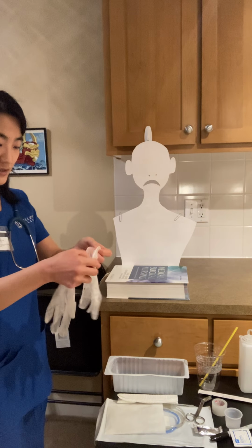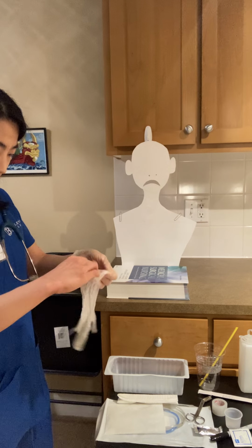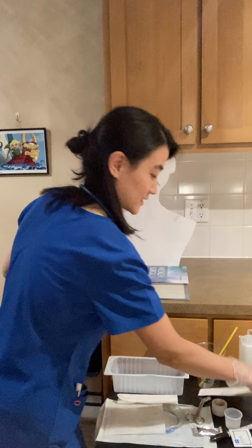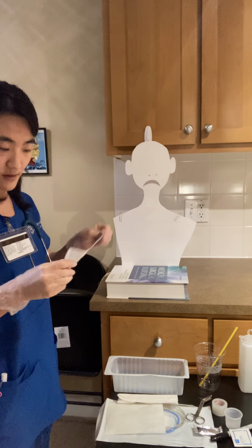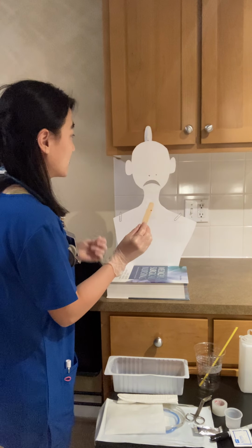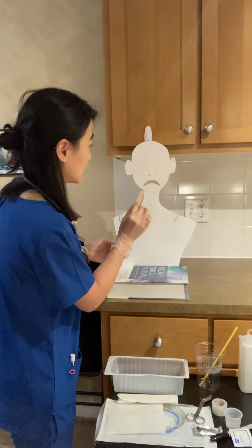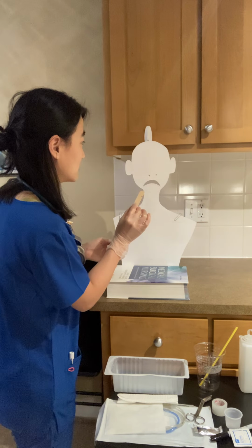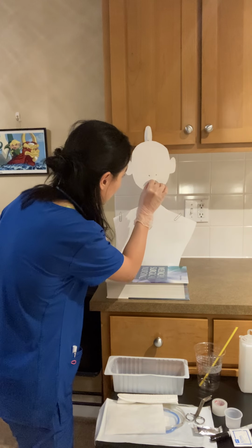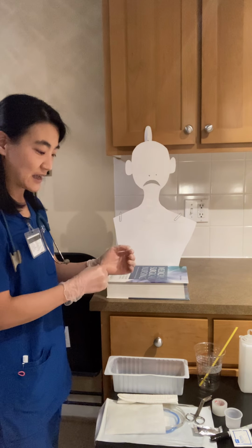I'm going to put on some gloves. And I'm going to assess for his gag reflex using this tongue blade. Alright, Mr. Nguyen, can you open your mouth and stick out your tongue? I'm going to use this tongue blade to gently touch your uvula at the back of your mouth, and that is to just test your gag reflex. Gag. Alright, so his gag reflex is in fact intact.